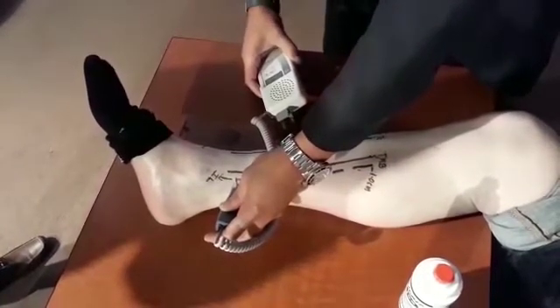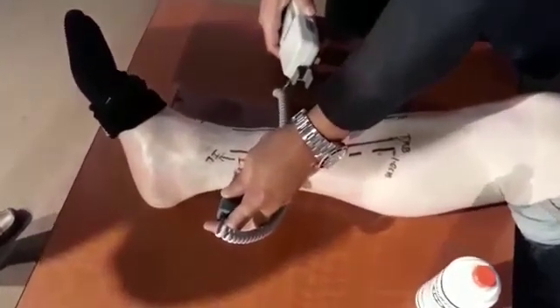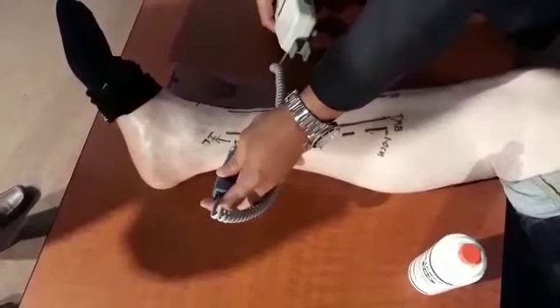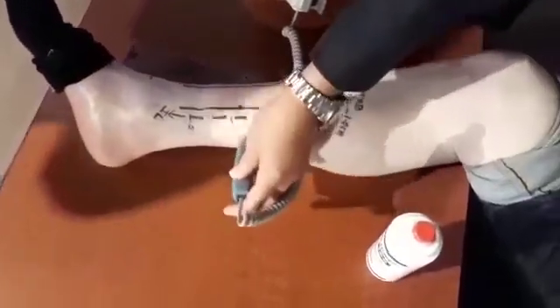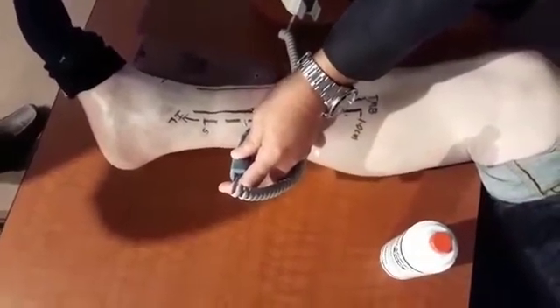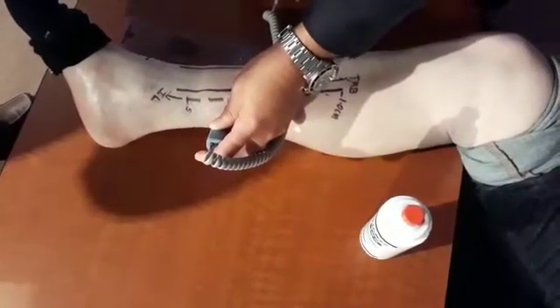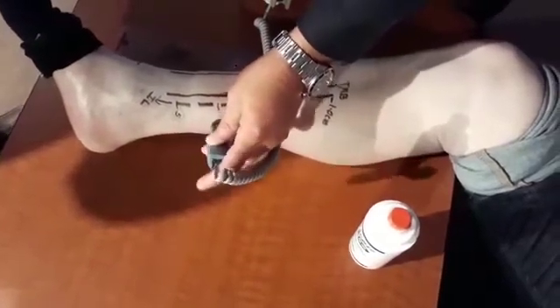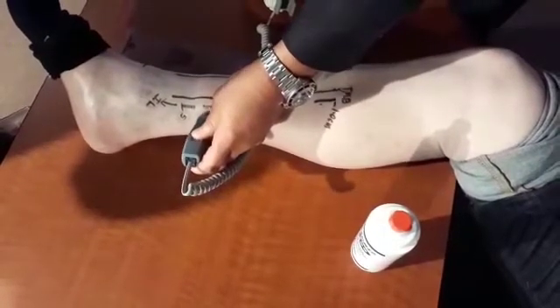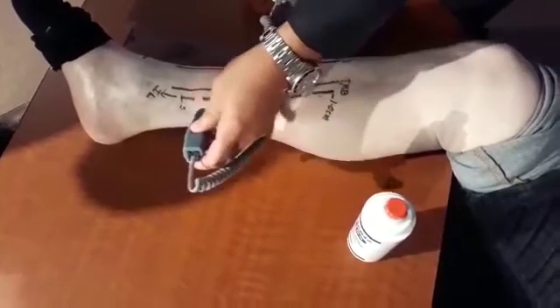You guys hear it? That's a five. Now we're going to go to the 10. If I go between 5 and 10, it will be a choke vessel — very little sound. So that tells you that 5 is a perforator, 10 also.